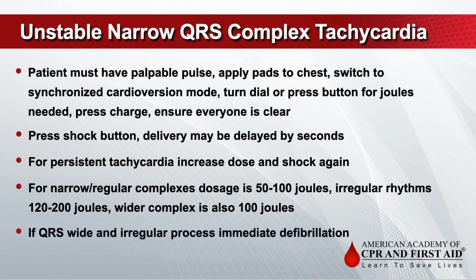If the QRS is wide and irregular, you are unlikely to have a pulse. Proceed with immediate defibrillation in the unsynchronized mode. Each machine is a little different, so make sure you know how to effectively use the model you have available.